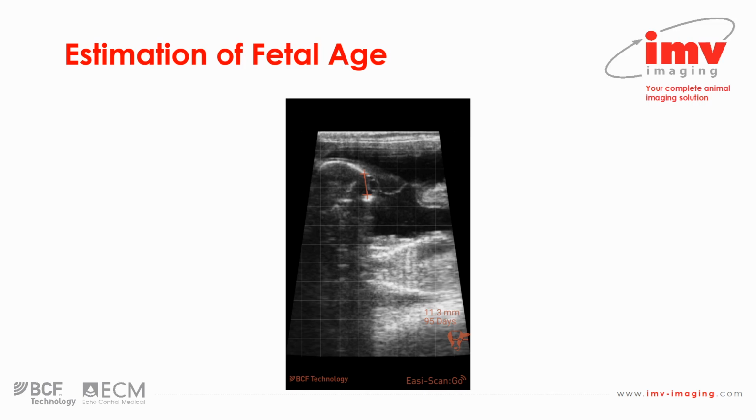So we can be confident that we're looking at the zygomatic arch and lateral wall of the skull there, and then we can see the lens of the eye, so we know we're measuring the globe diameter between those calipers. It's not very easily discernible, but in the bottom right corner of that still you can perhaps make out the measurement 11.3 millimeters, and correspondingly 95 days, and the little logo there just reminds you that you were measuring cattle orbit diameter, to ensure that you haven't selected the wrong measurement and made an error.